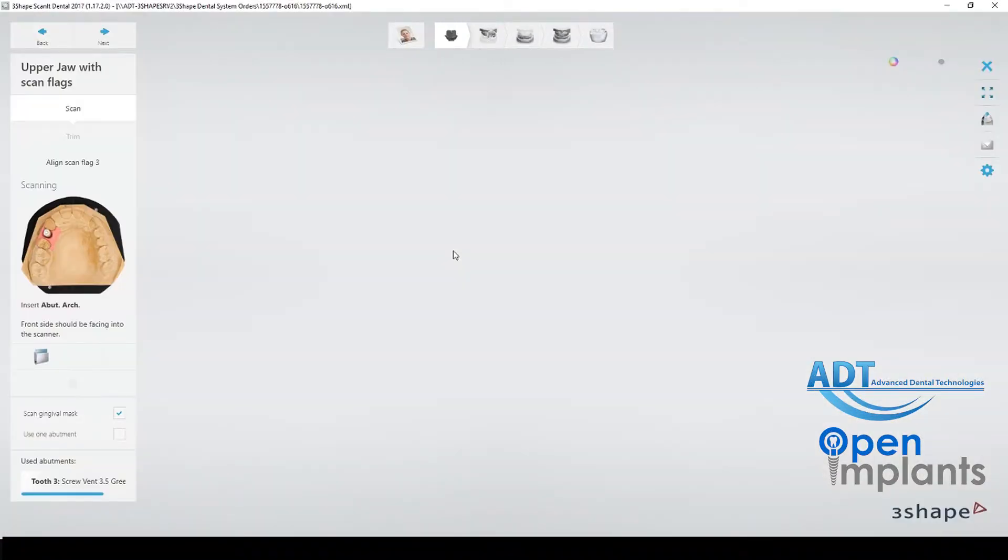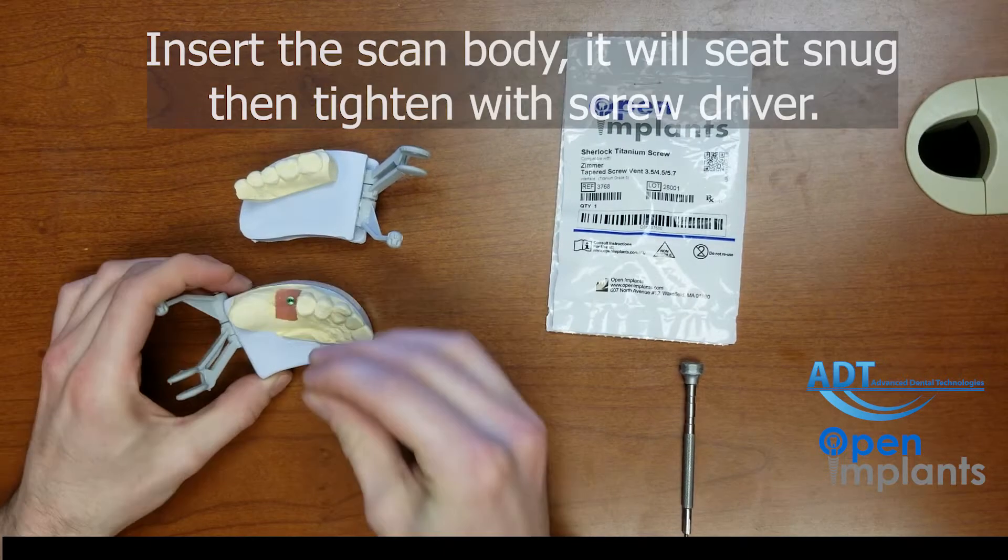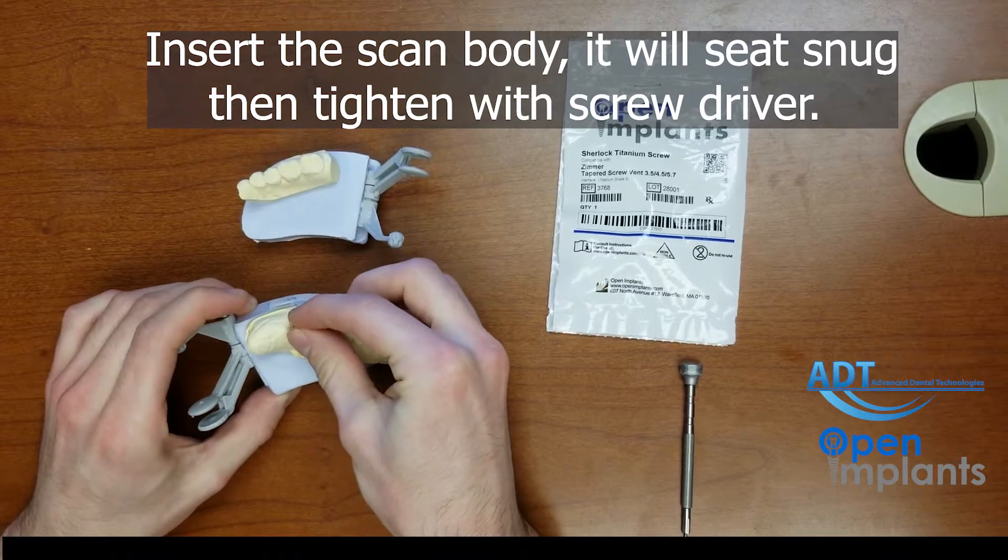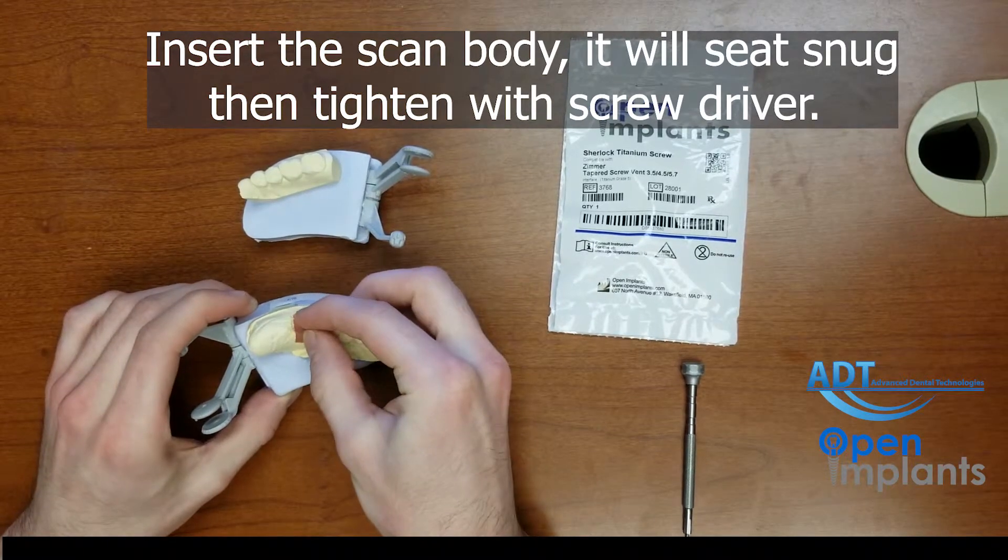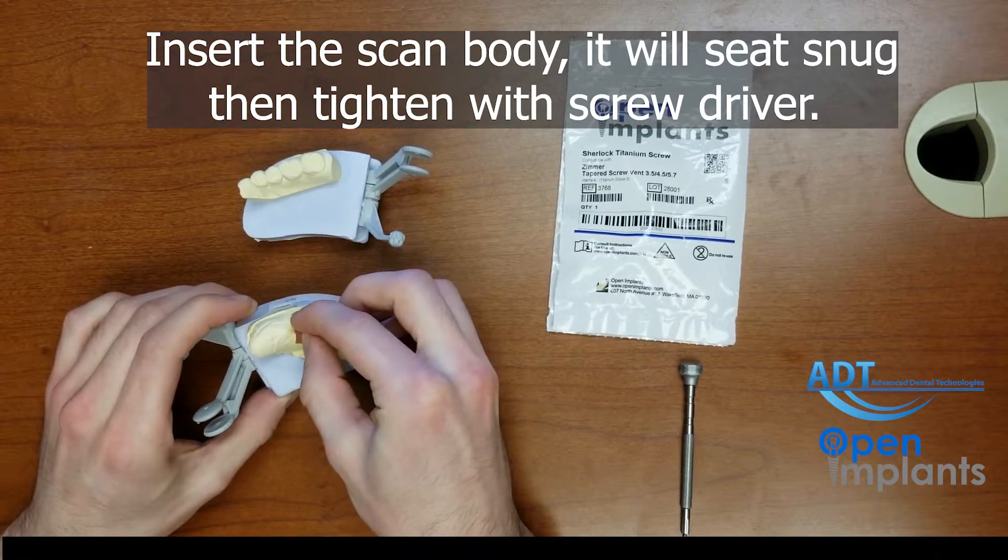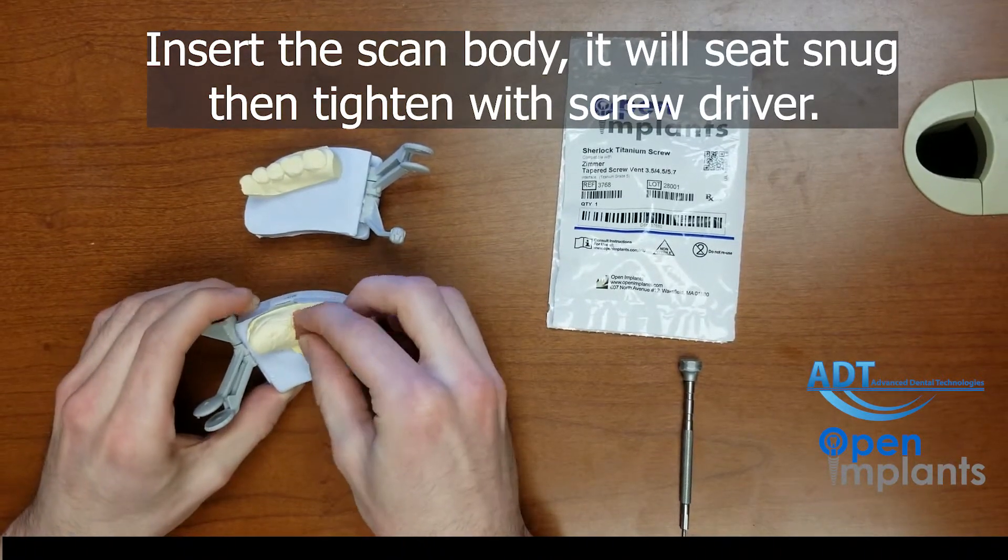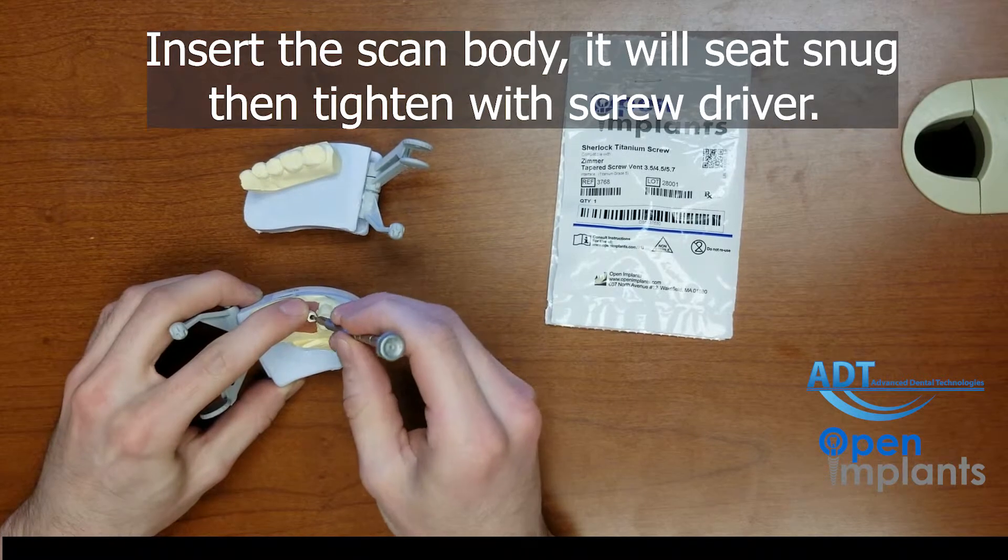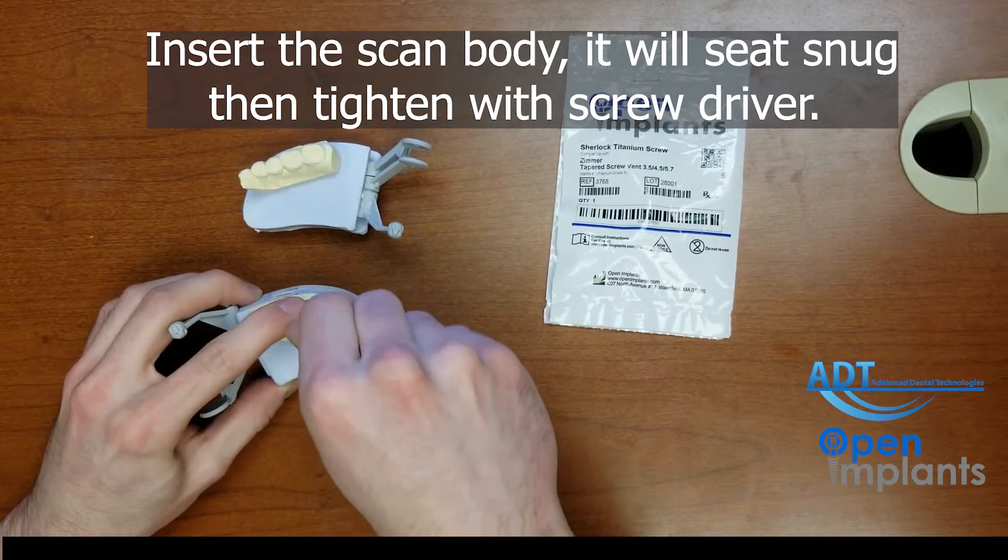Now that's done and we will go ahead and insert the scan body into the model. Alex is inserting the scan body and it sits nice and snug. He is now screwing down the screw with the appropriate driver.